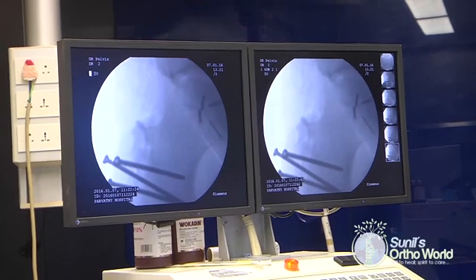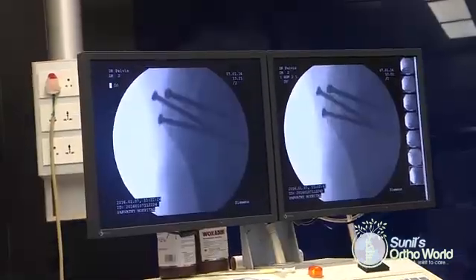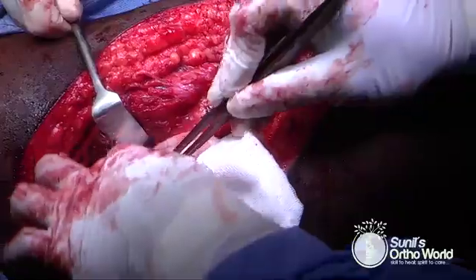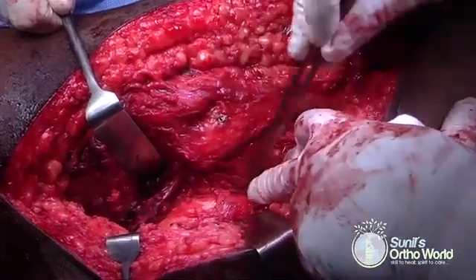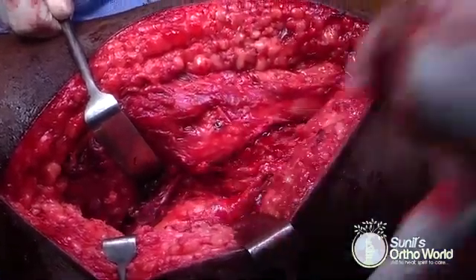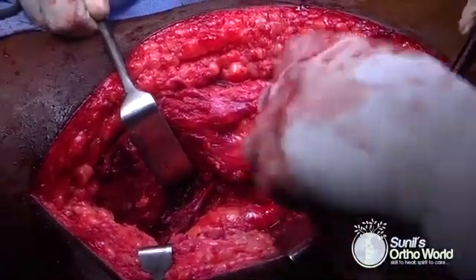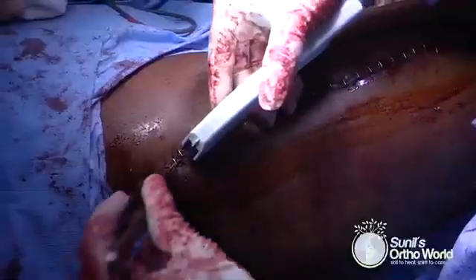The quality of reduction of the fracture and osteotomy is checked using fluoroscopy and the hip joint is assessed for congruency. You can see the posterior fibers of the gluteus medius that were left behind, the piriformis tendon, and the entire posterior structures left intact after the surgical procedure. The wound is now closed in layers with a suction drain.